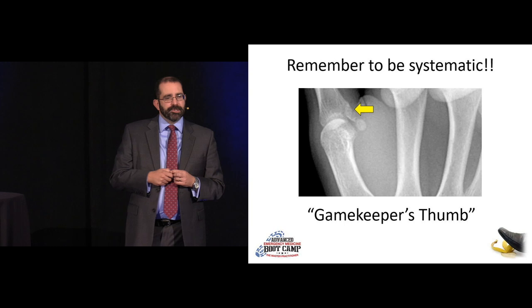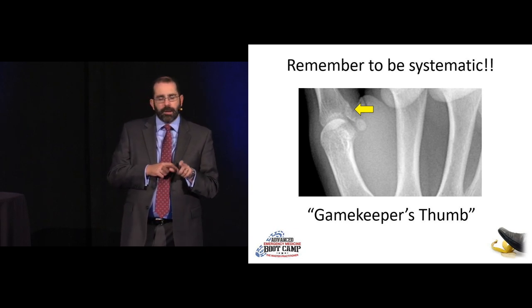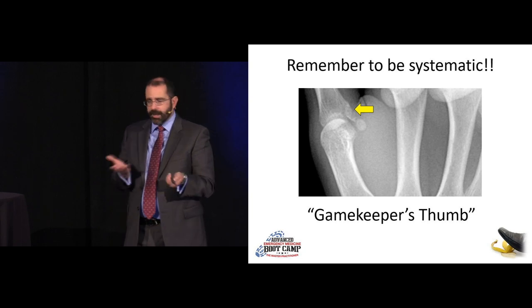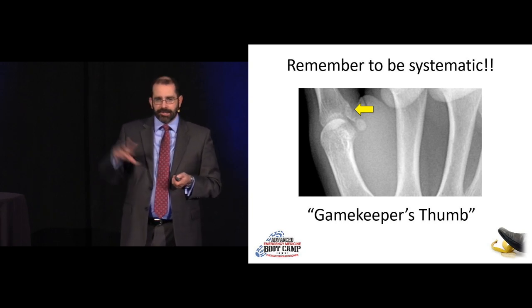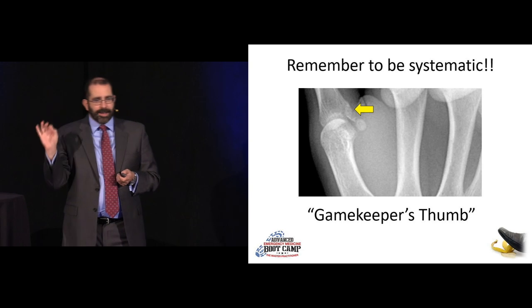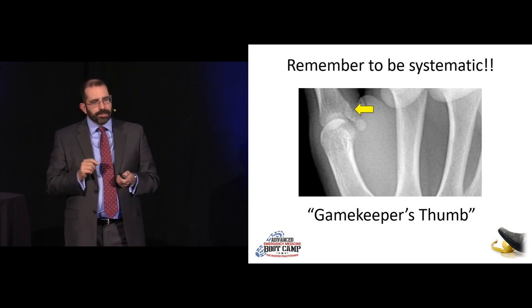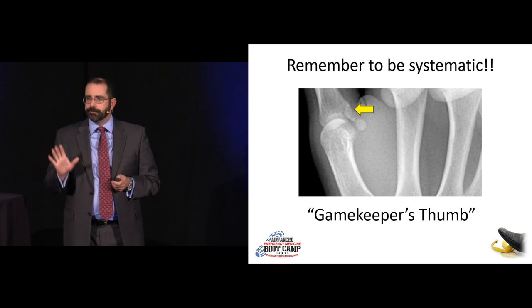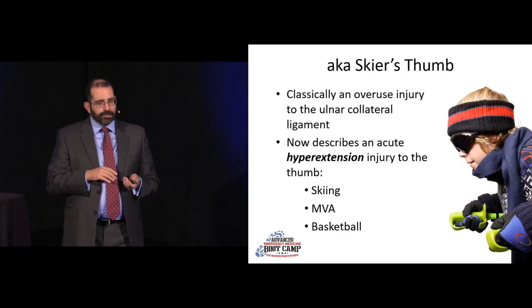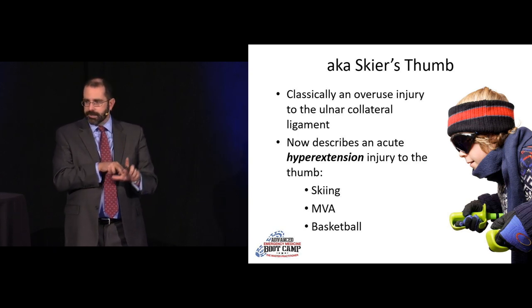It actually does matter. This is known as a gamekeeper's thumb or skier's thumb — an injury to the ulnar collateral ligament of the thumb. You can have a pure ligamentous injury without a bony fracture, which can be very subtle, but here the fracture guides us. The problem is this is what allows pinch and grasp — that's what separates us from other animals. Delay in treatment worsens prognosis. If you see this, get very prompt orthopedic follow-up.